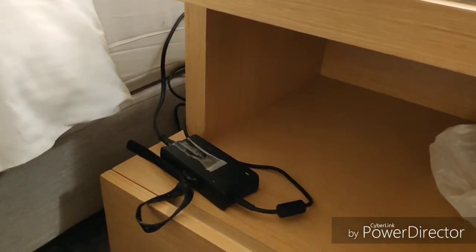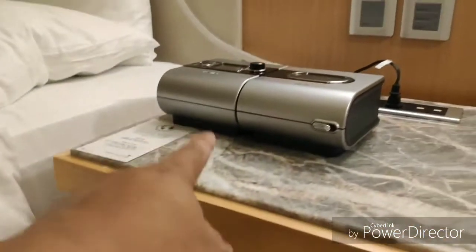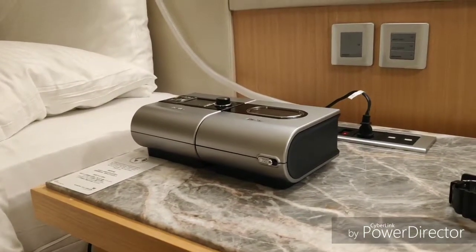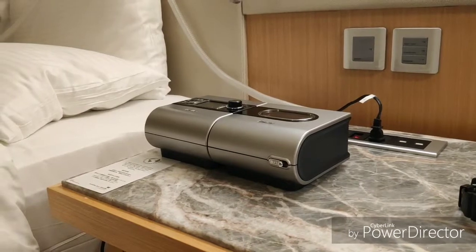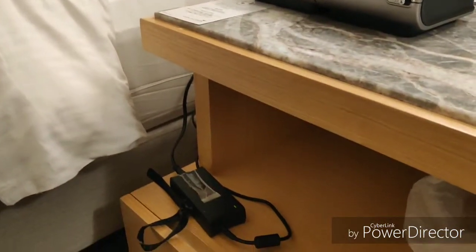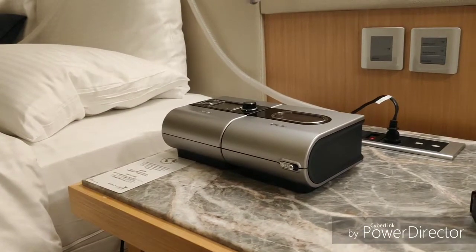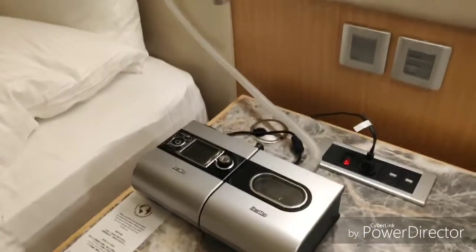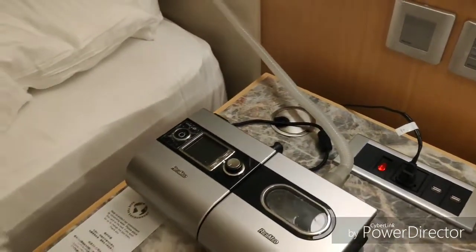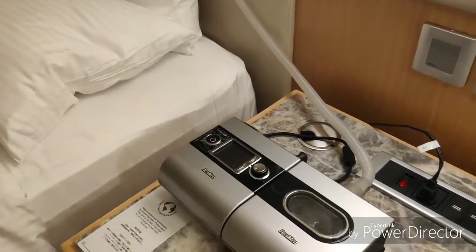Next thing you want to do is avoid putting the power brick close to your device. For one, these devices have multiple sensors to accommodate for humidity setting, etc. And so the heat that might come off from the brick or the power supply might affect the sensors or how effectively it could work. Obviously, I'm not using a climate line or automatic type of heated tubing. I'm just using a simple slim line, which is very light, easy to travel with, and doesn't have any drag on the mask.